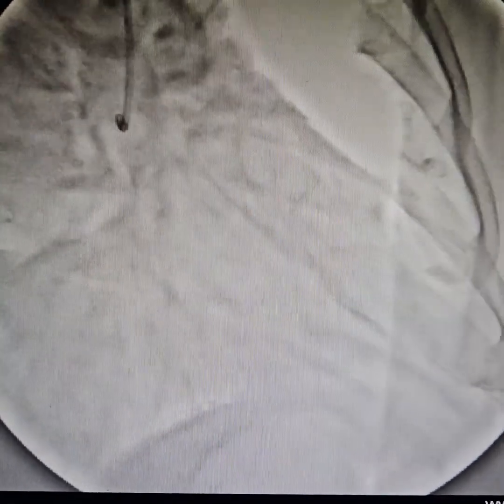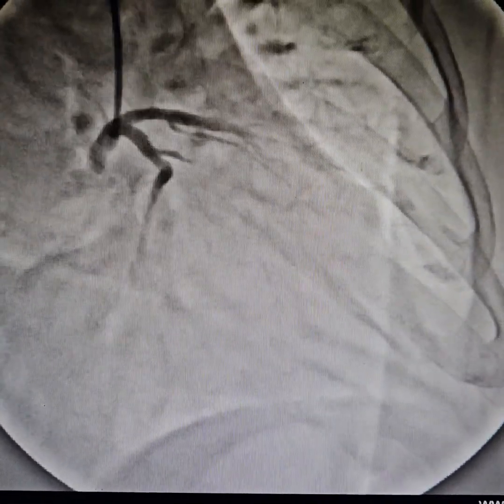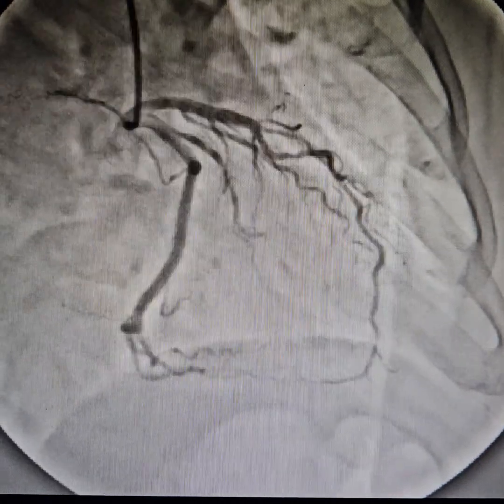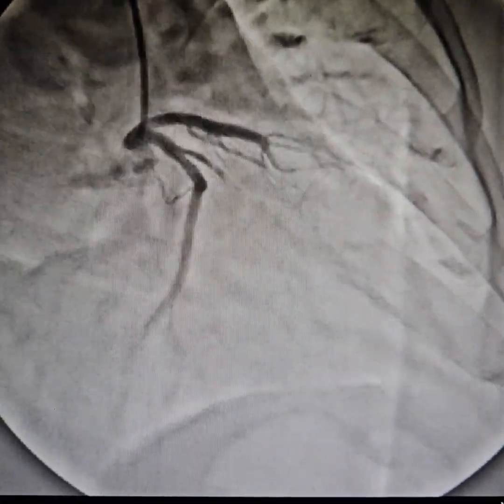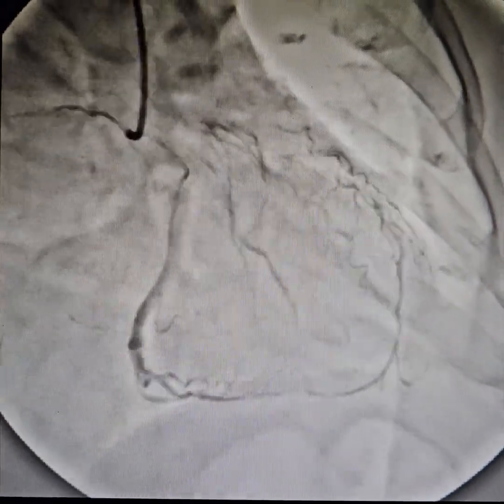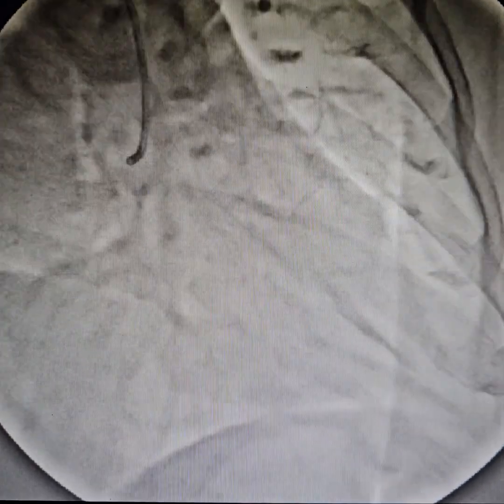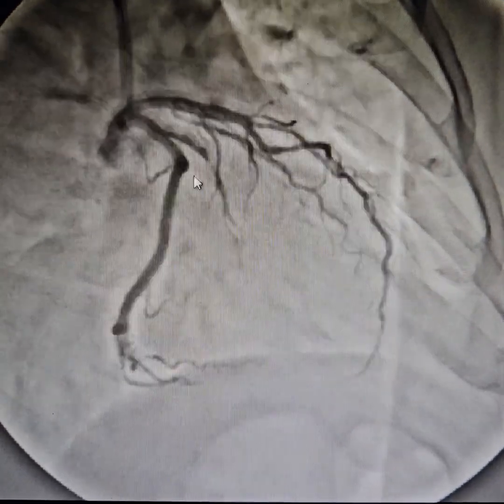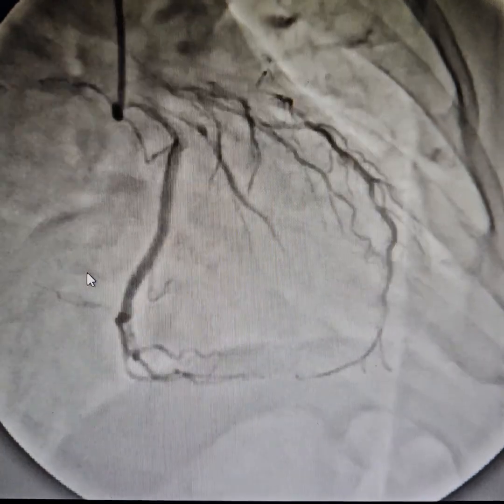Hello everyone. This is an educational video for budding cardiologists to take some tips and tricks for obtuse marginal artery angioplasty and stenting. As you can see, this patient has an inferior lateral wall MI.